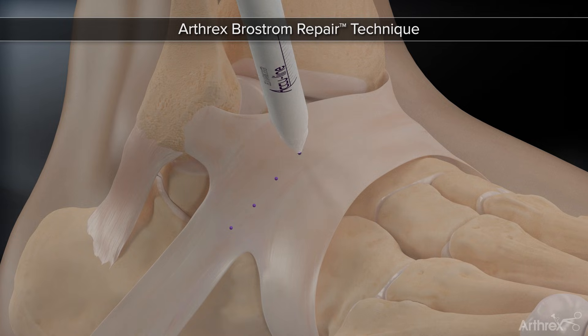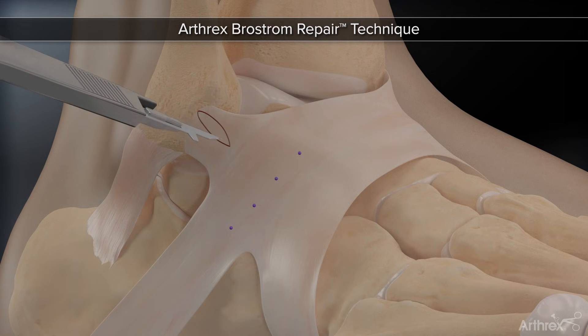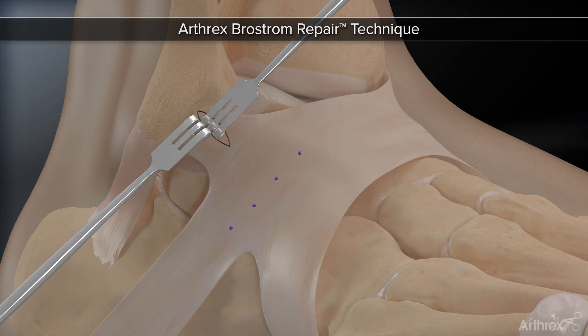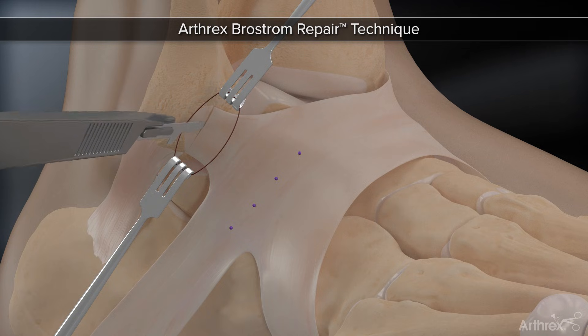Initially, a small 1.5 cm incision is created at the distal tip of the fibula, in line with the course of the ATFL from the fibula to the talus. Dissection is carried out and the diseased ATFL is carefully detached from its fibular insertion point.